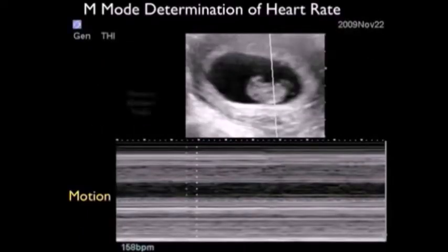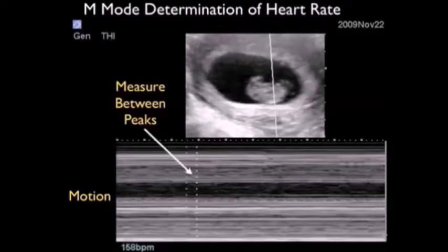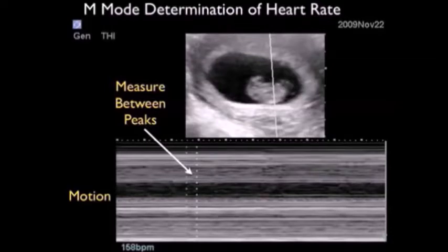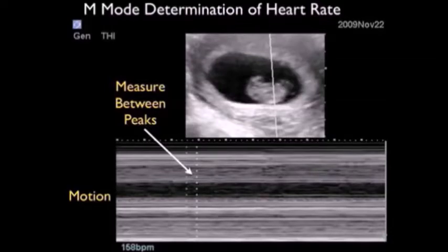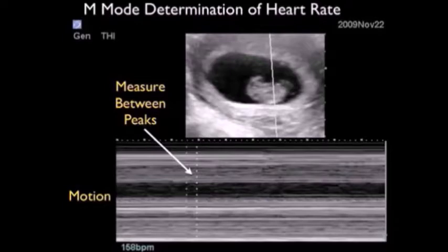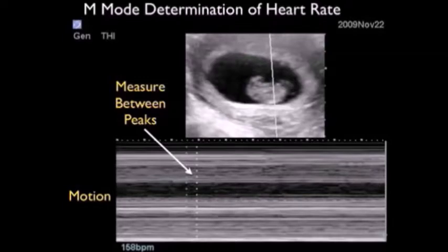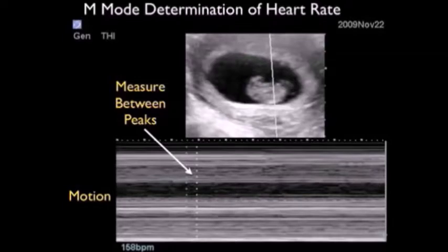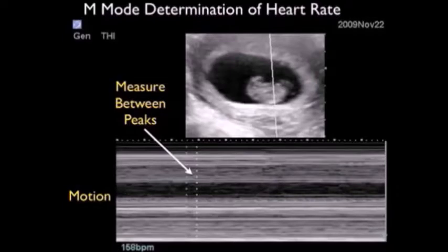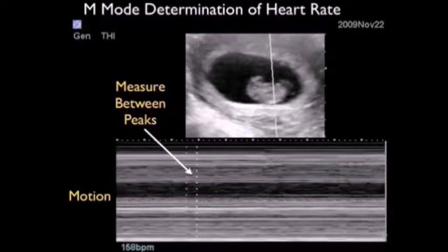Here we're going to use M-mode to determine the fetal heart rate. Notice we have the fetus zoomed up towards the top of the image, and we're placing the M-mode caliper directly over the fetal heart. Towards the bottom, we see the M-mode motion strip, and notice the little waves showing the motion of the fetal heart. On this particular ultrasound machine, we measure between each peak, and we can see a heart rate determination of 158 beats per minute. This is something we can print out and place on the chart to show that at the time we saw the baby, there was an actual heartbeat.